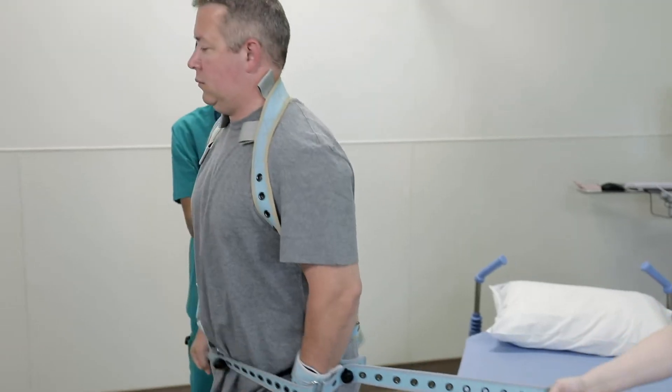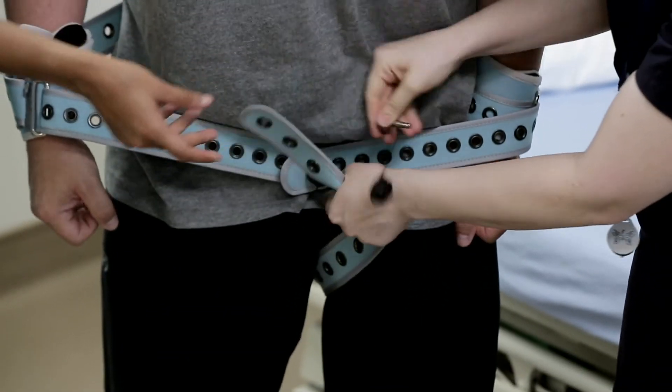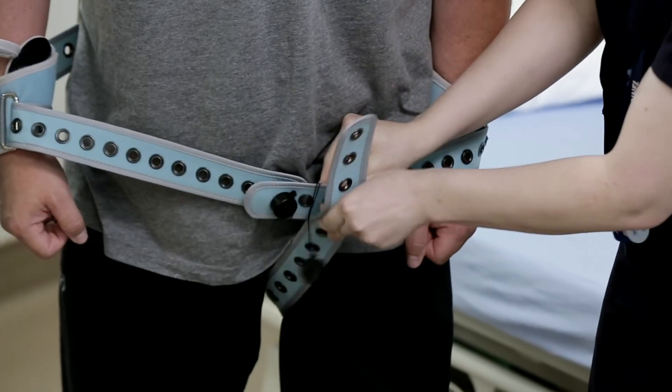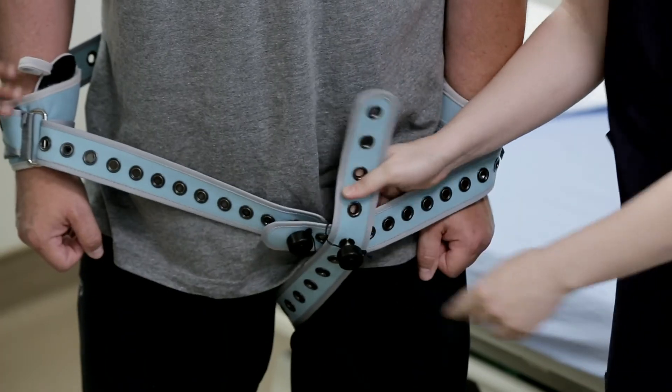If upward movement is a concern, pass the long strap of the limb belt between the patient's legs and attach it to the front of the joined wrist straps. The patient is now able to walk without concern for any type of attack.